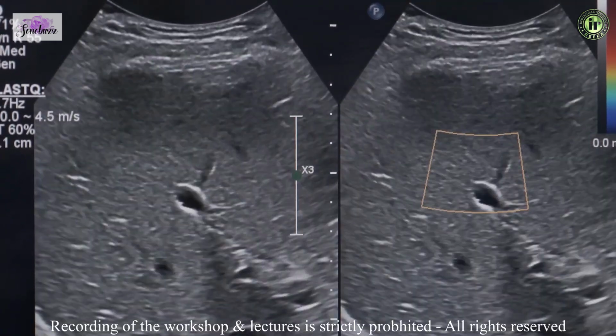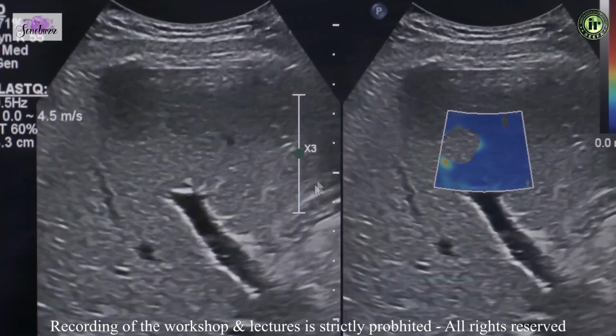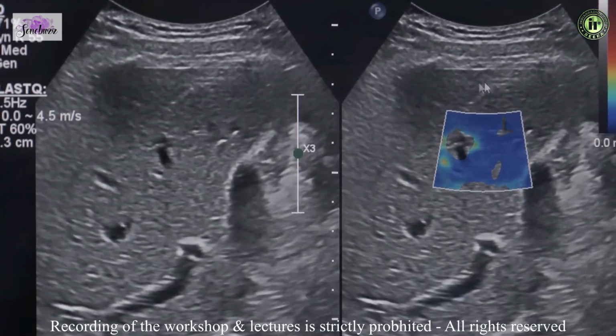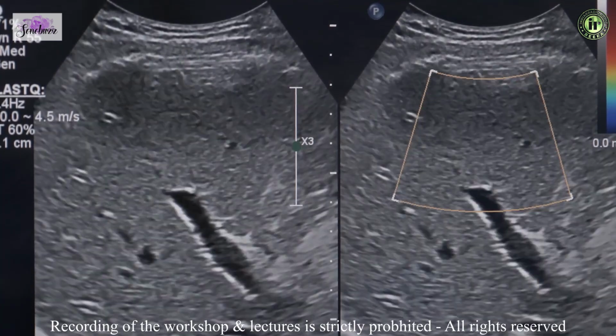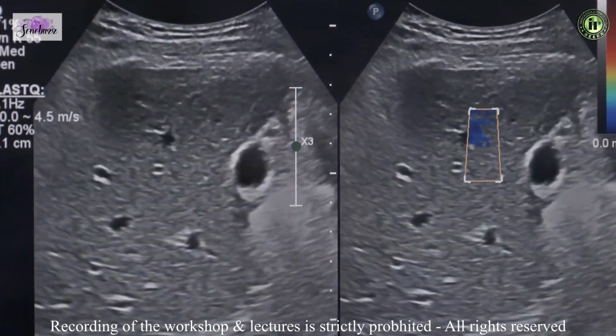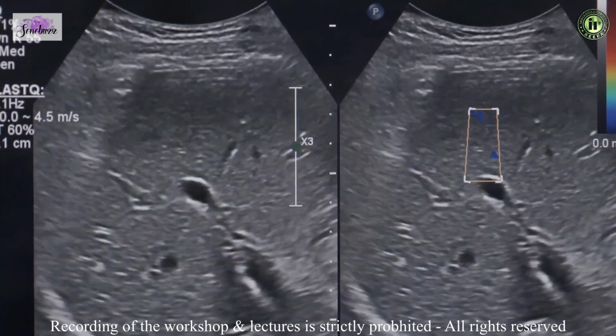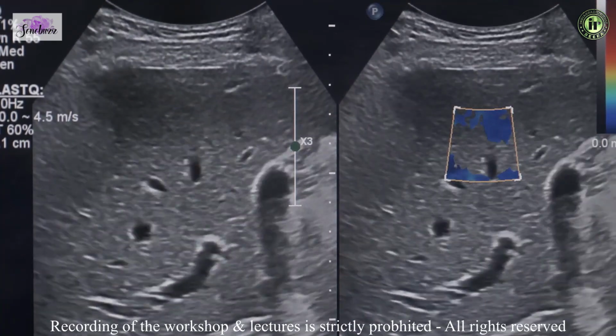So now you can see that when I have turned on my elastography box, instead of that small box that I had in the point shear wave, I have quite a large box over here. The box can be changed in size. As you can see, I'm making a large box, I'm making a small box over here. So you can vary it from study to study and take your readings.